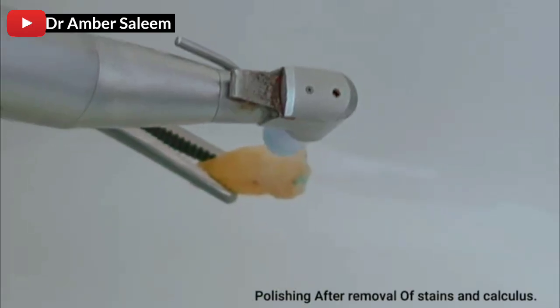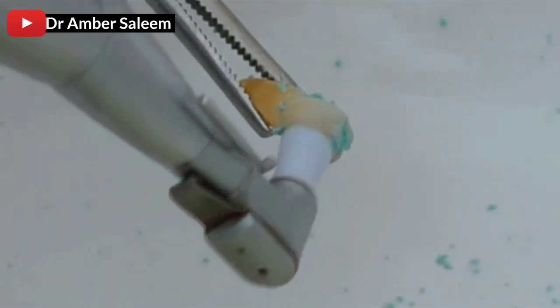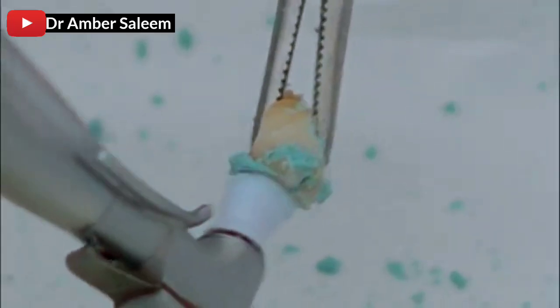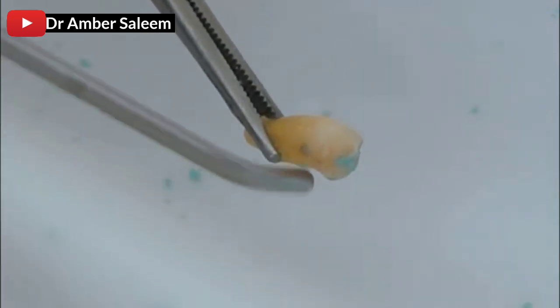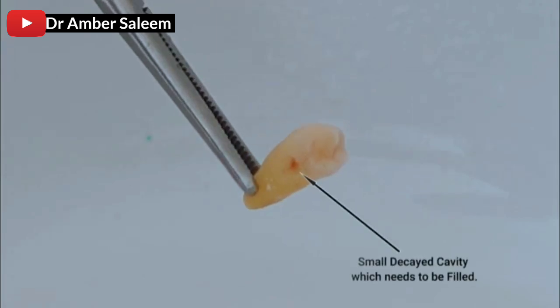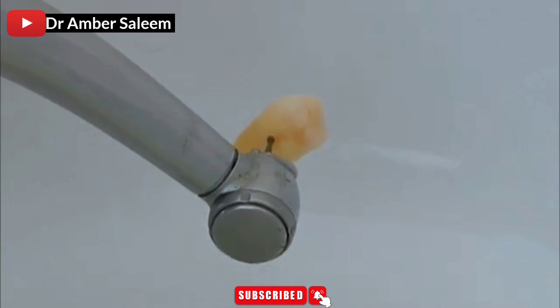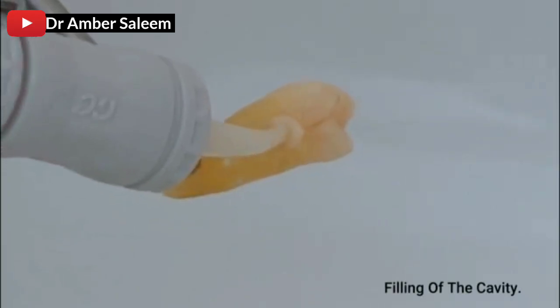Polishing after removal of stains and calculus. Cleaning with air water spray — small decayed cavity which needs to be filled. Removal of decayed cavity, drills, filling up.